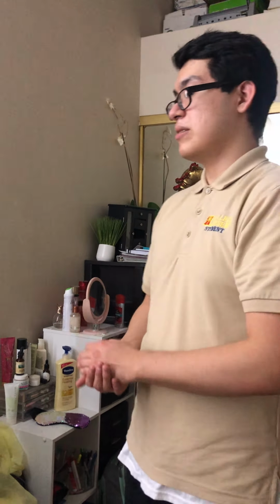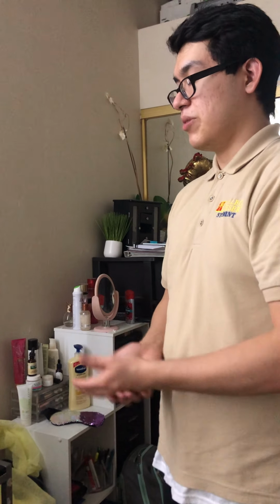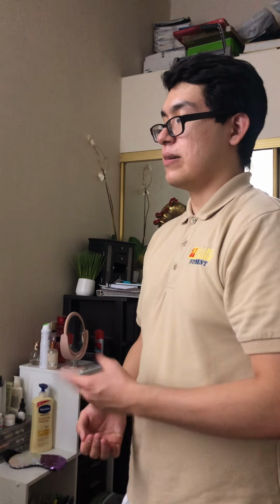The reason for tracheostomy care is to remove any of your dressings and your inner cannula, give you a new dressing, give you a new inner cannula. That way there's no skin breakdown, no infection, and at the same time I'm going to be cleaning some secretions around that area. Do you have any questions?